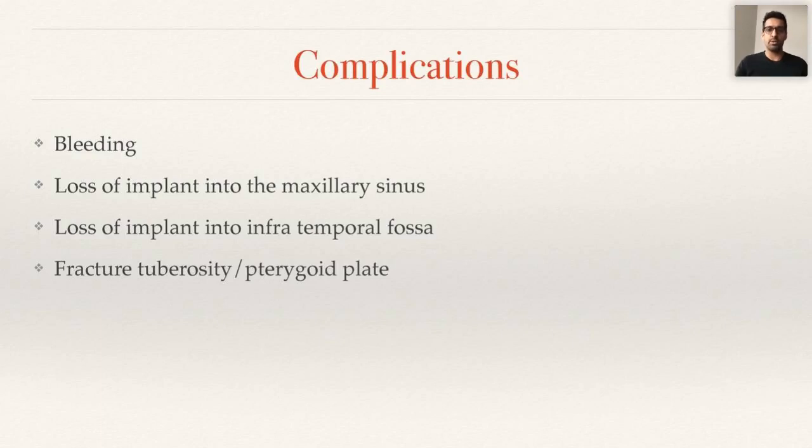Can everybody just let me know, was that clear? Everybody was able to see the videos and it was clear to them what I was trying to illustrate. So if you look, the first video, I used a contra-angle handpiece. I was on the left side and I was using my Versa drills.